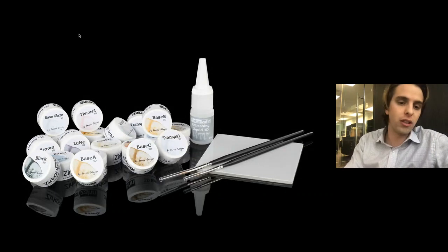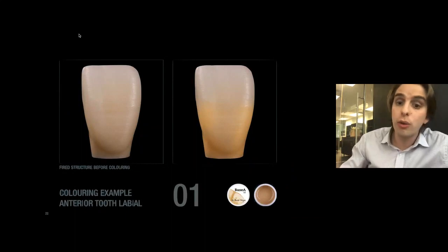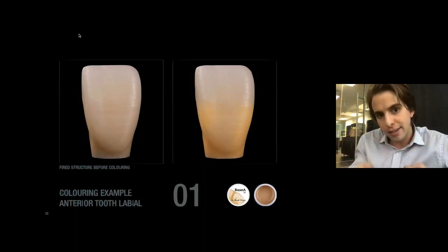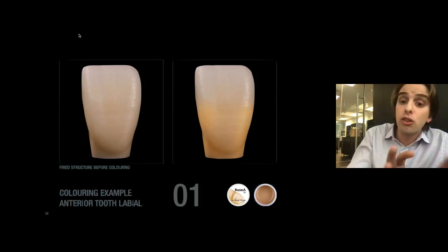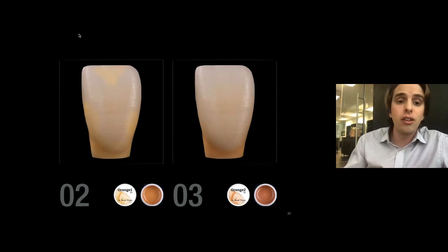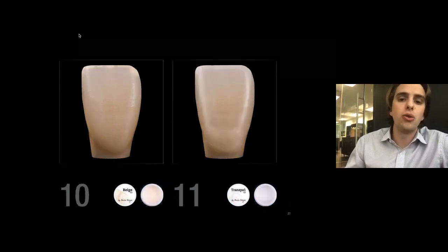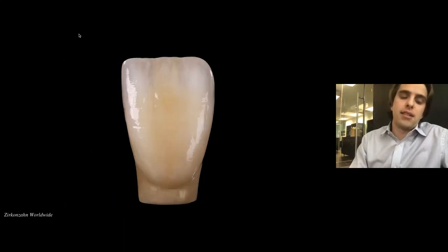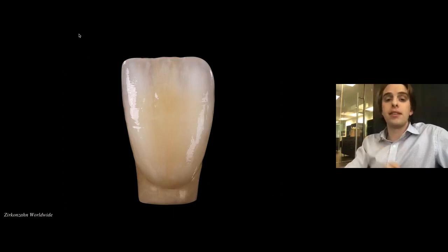And so we use the 3D stains by Enrico Steger. And again, we have a very nice paint by number sequence, but it's following a specific concept of playing with opacities of materials and playing with chromas of materials in certain aspects of this tooth. And so we go to apply this through the various bakes, and you have a beautiful restoration at the end. So you're going to go home and practice these things.